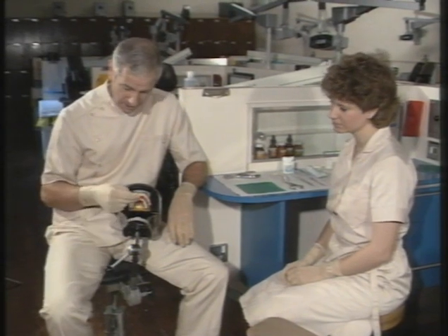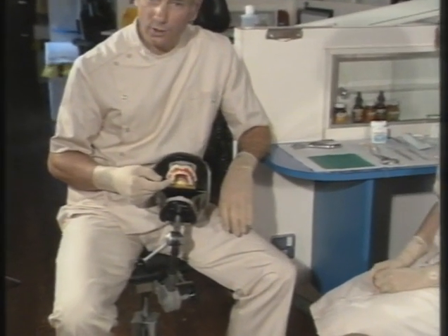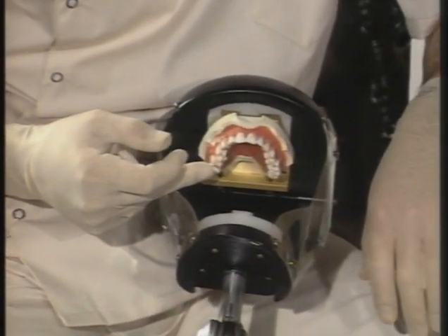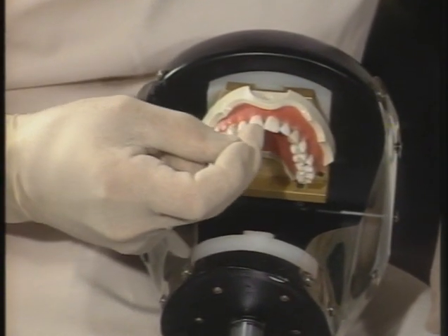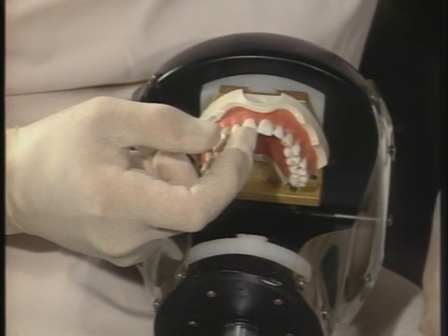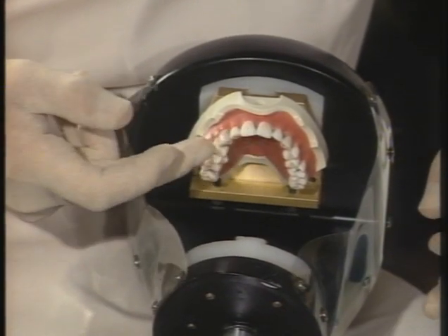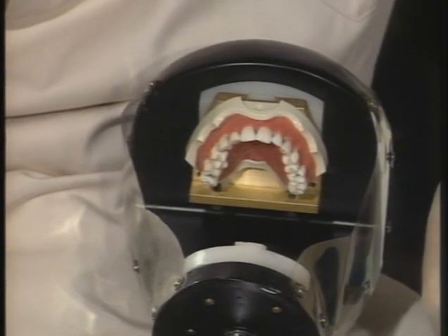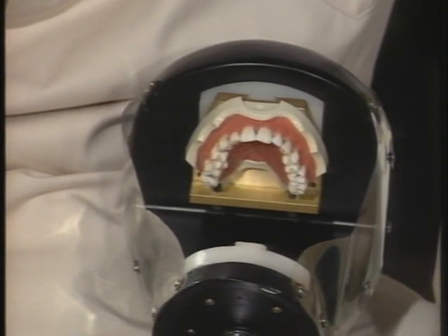Chris and I would now like to show you the placement procedures for rubber dam using this phantom head model. I'm going to place the rubber dam on the upper right quadrant, and I've already decided that the last molar tooth will be the posterior anchor point, and that the anterior anchor point will be the interspace between the two upper central incisors. The teeth have already been flossed so that I know how loose or how tight the contacts are, and I'm aware of the possibility of there being any snags there.